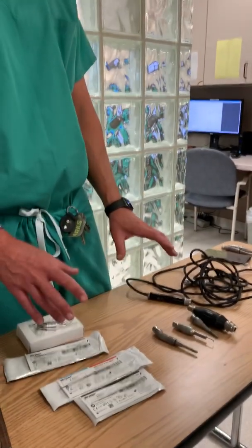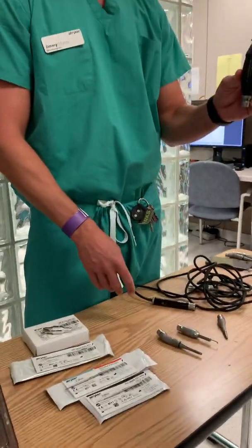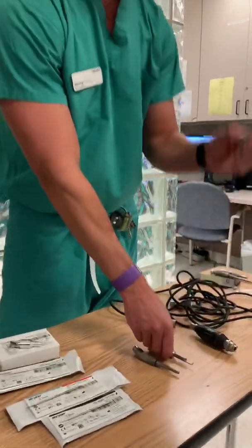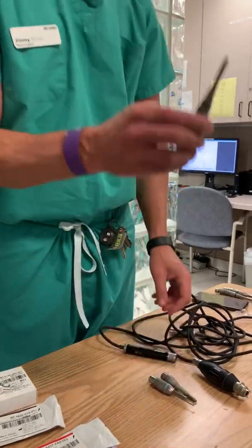When you're pulling for this case, or when you're setting up for every craniotomy, you need four things: you need this perforator, you'll need this red one, you'll need this blue one, and you need this black one.